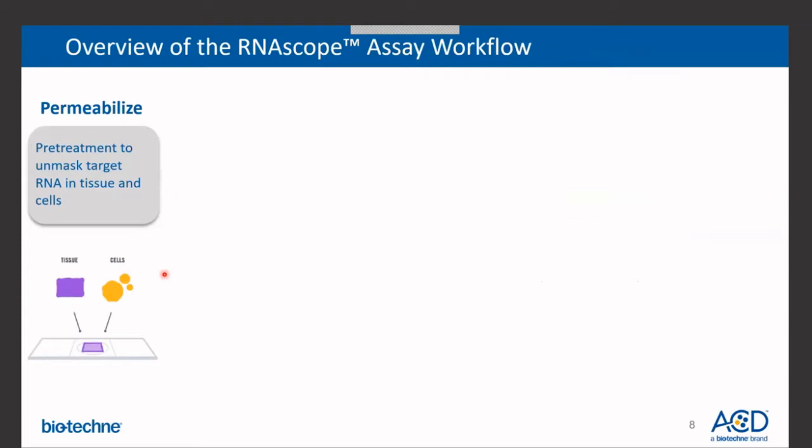RNAscope works whether you have formalin-fixed paraffin-embedded tissue, fixed frozen samples, fresh frozen tissue, or cultured cells. The pre-treat portion of the assay will just change depending on what your sample type is. Side note, for HiPlex, we don't recommend using HiPlex for FFPE samples because autofluorescence is an issue. We have a different RNAscope chemistry for you that I'll mention at the end of this webinar.